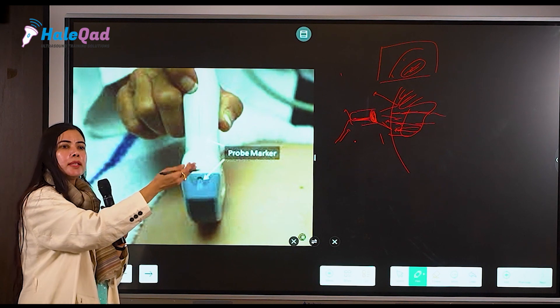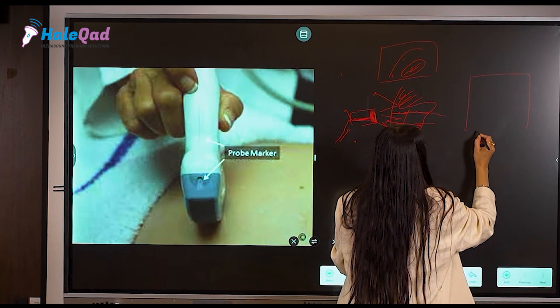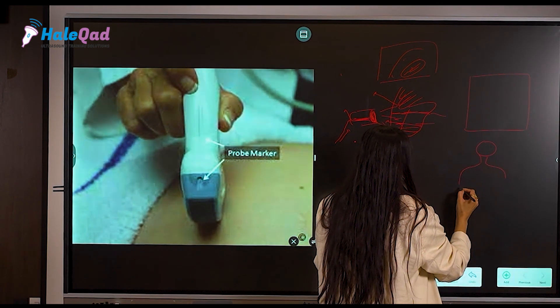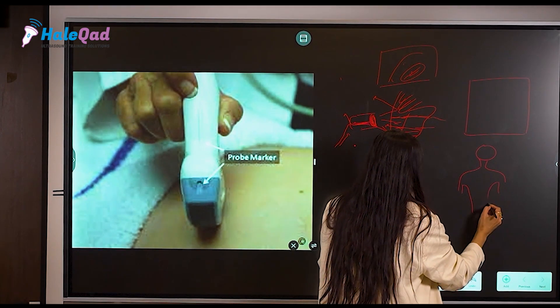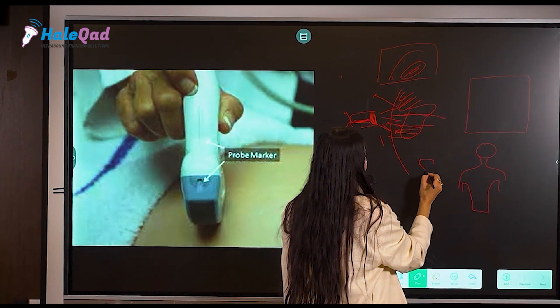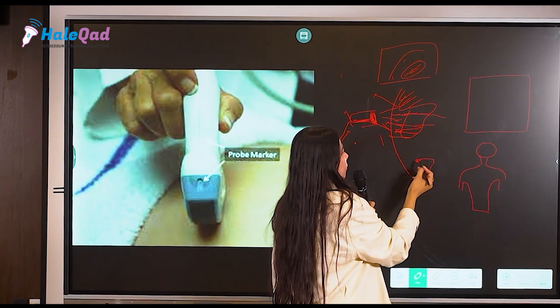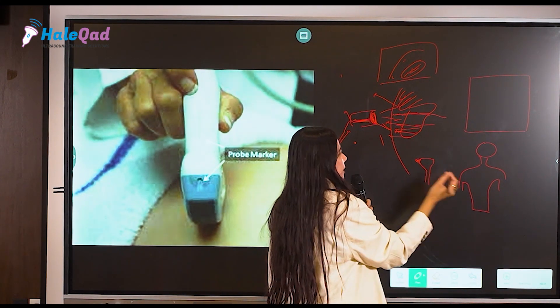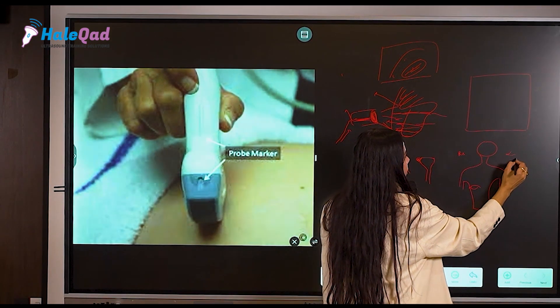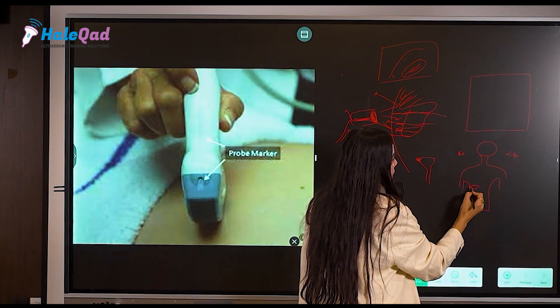If you are holding this marker on the right side of your patient, then your monitor will be representing everything on the right side. Your patient is lying like this, your convex probe is placed on the abdomen, and the marker should be oriented towards the right side of the patient.